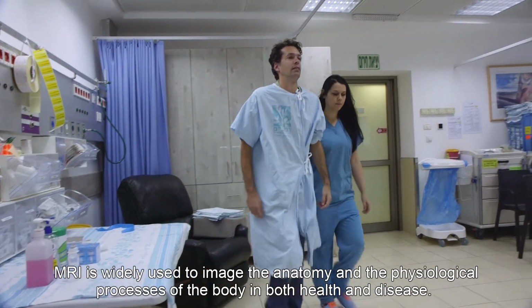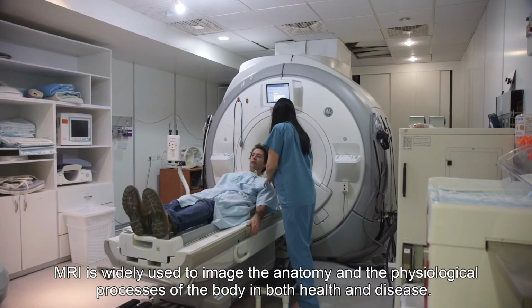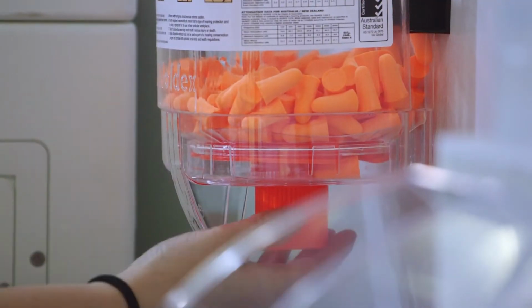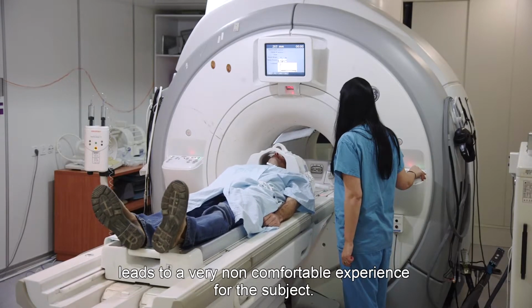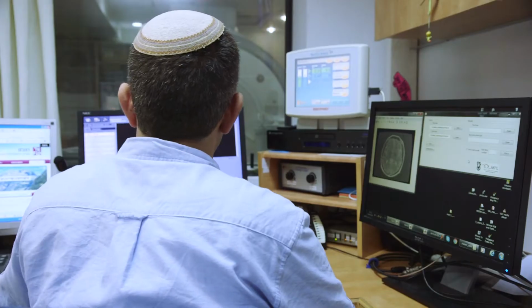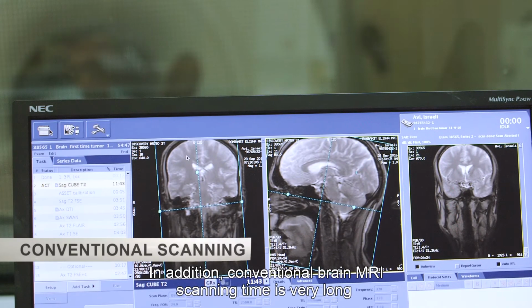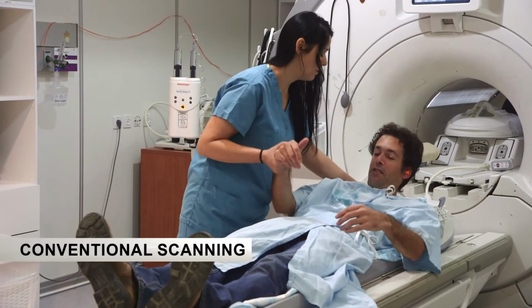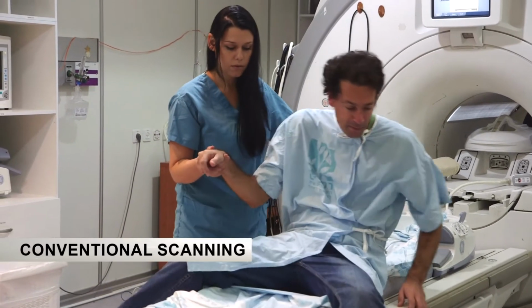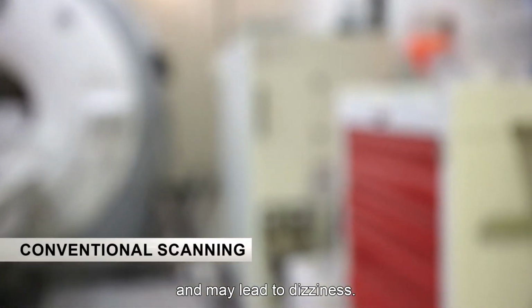MRI is widely used to image the anatomy and the physiological processes of the body in both health and disease. The noisy and claustrophobic environment leads to a very non-comfortable experience for the subject. In addition, conventional brain MRI scanning time is very long and may last around 1 hour. The current scanning scheme results in inconvenience for the patient and may lead to dizziness.